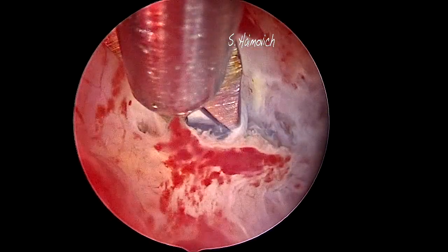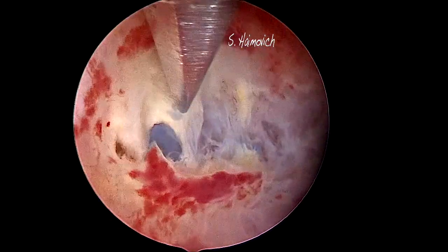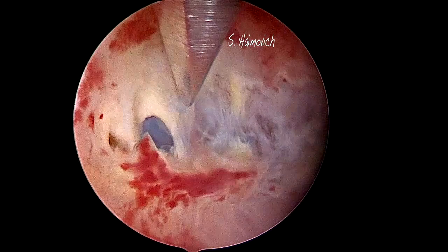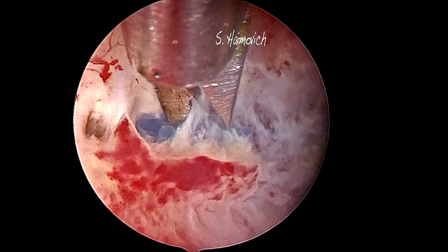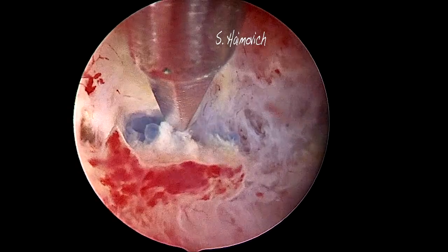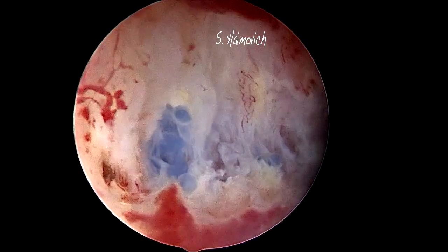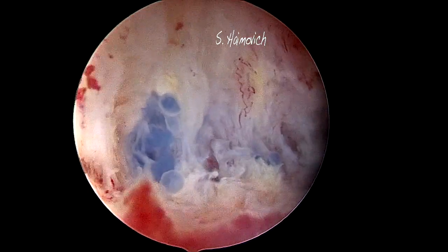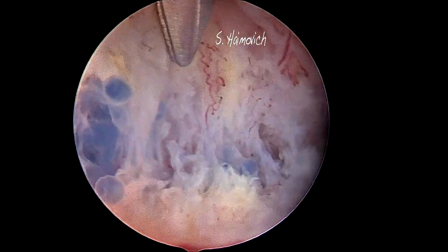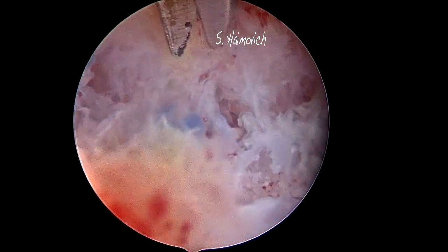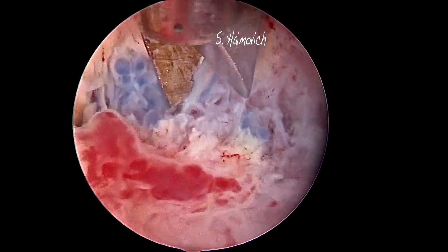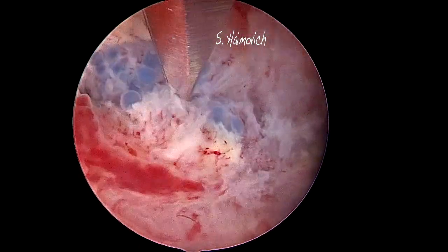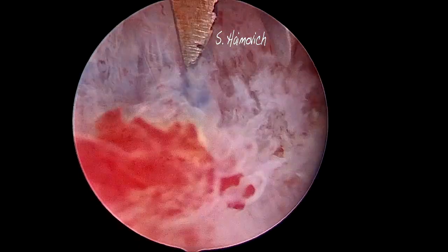Suddenly a dark blue image is seen. At the beginning we thought it might be a blood vessel, but as we continue opening the fibrotic tissue, a picture of small blue spheres appeared. These are the spheres of the uterine artery embolization that were responsible for the fibrotic adhesions.